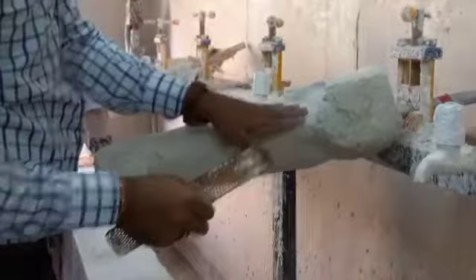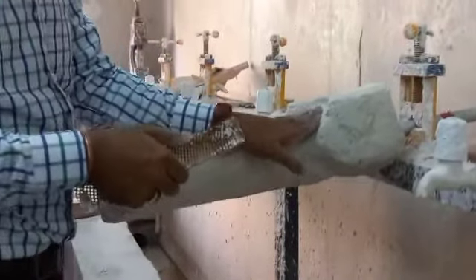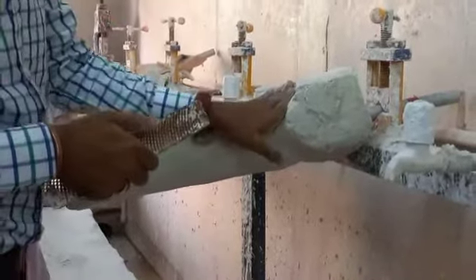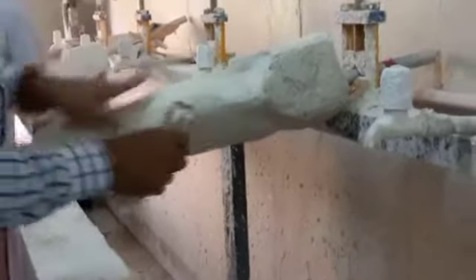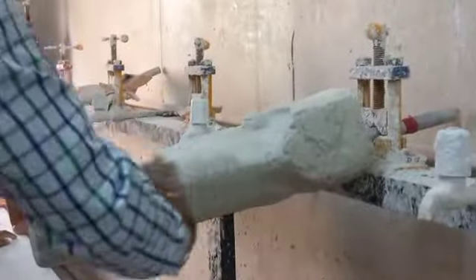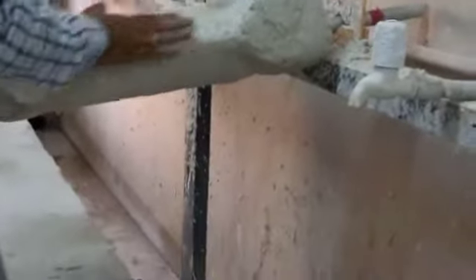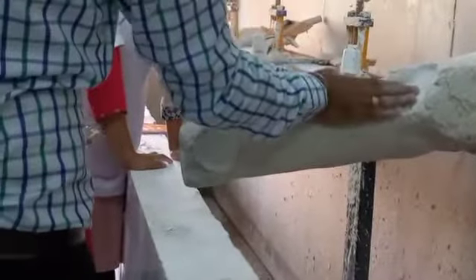And see, the surface of this posteromedial aspect of the area where you are really giving the catch, just below this catch area it should not be abrupt. It should be smoothing down, a flattened wall. Just because in this area you are loading the soft tissue of the posteromedial aspect, that is the adductor musculature. All these areas are being loaded, right? The hamstring muscle, the adductor muscle, these areas are there. So this must be loaded, flattened.